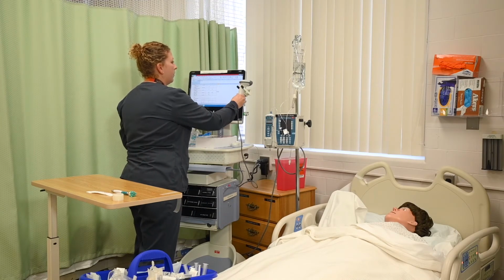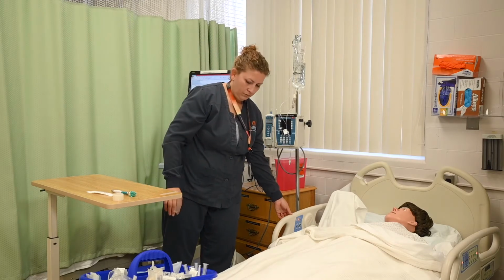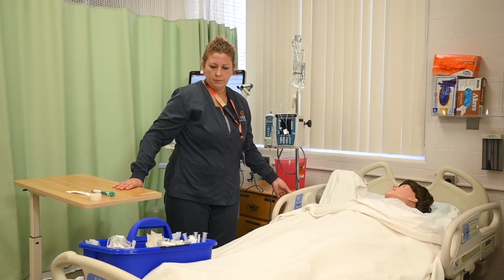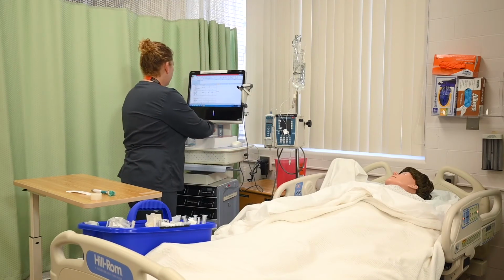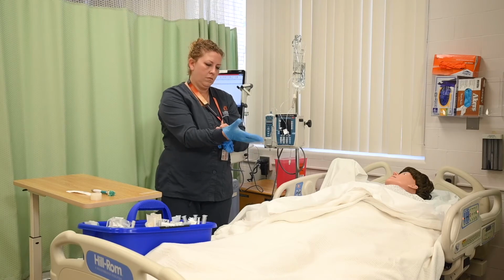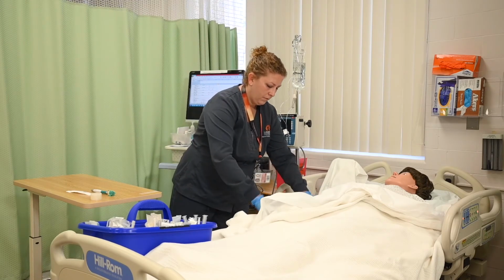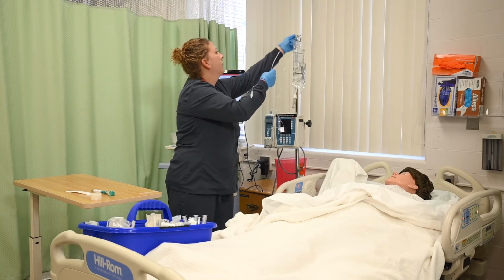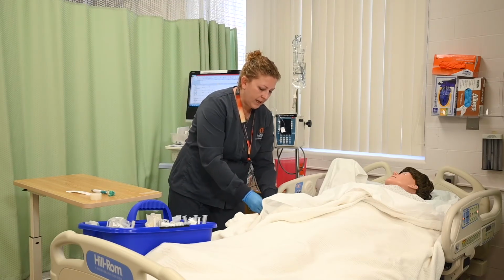Okay, if we were administering the IV solution, at this time, we would connect the prepared IV solution and tubing to the extension set. Use an alcohol swab or antiseptic wipe per agency policy. If a swab cap was not in place, I would use an alcohol swab and cleanse the port for 15 seconds.